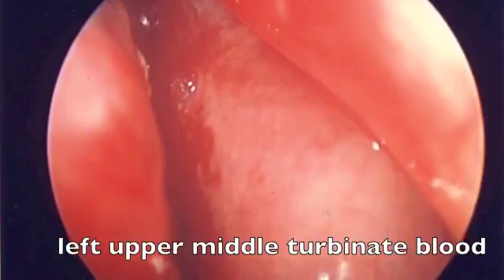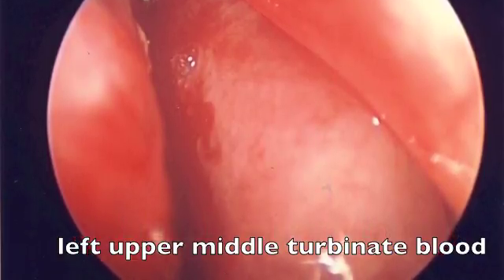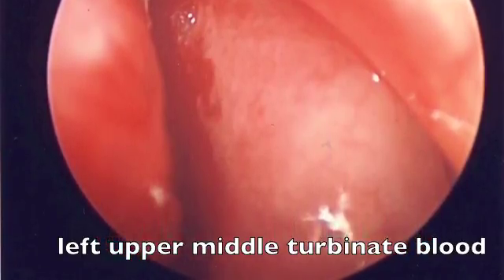After unpacking a patient, it's essential to identify where the patient may be bleeding from. In this picture, we see the patient is bleeding from high on their left side. They're actually bleeding from their anterior ethmoid artery, which would be ligated.